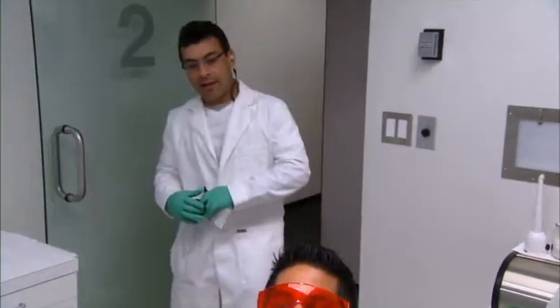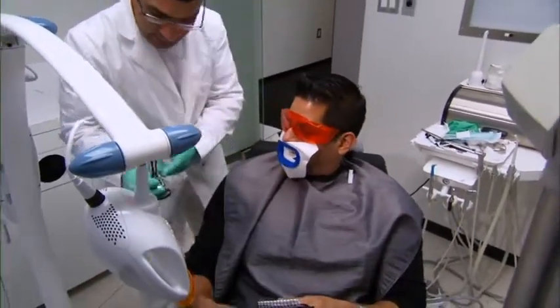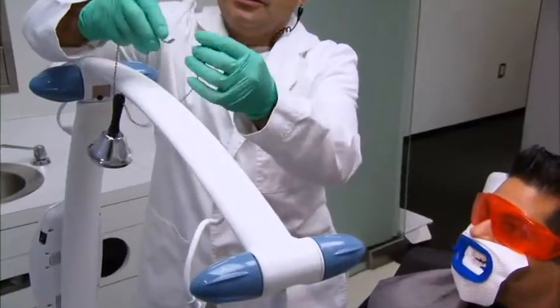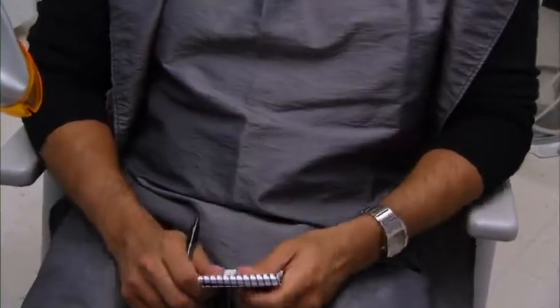Be sure to check on the patient regularly during the whitening treatment. If you plan to leave the room for an extended time, provide the patient with a means to contact you, such as a small bell. It's also helpful to have a paper and pencil available in case the patient needs to communicate.